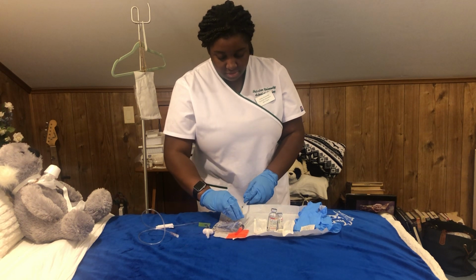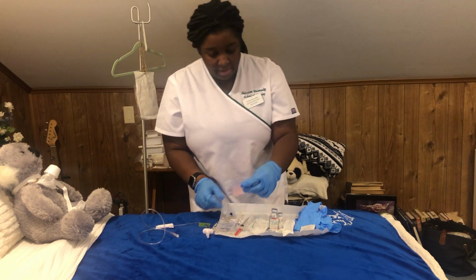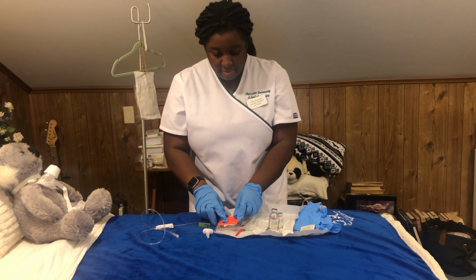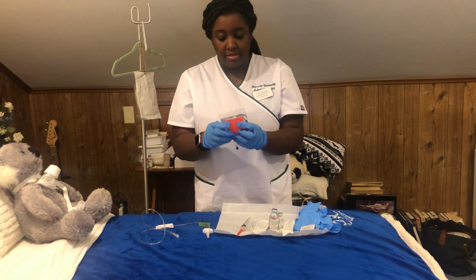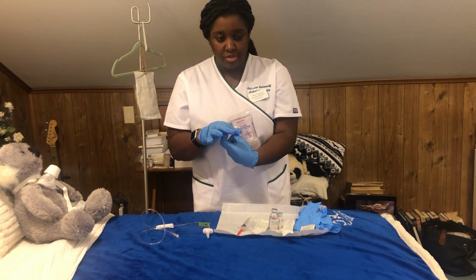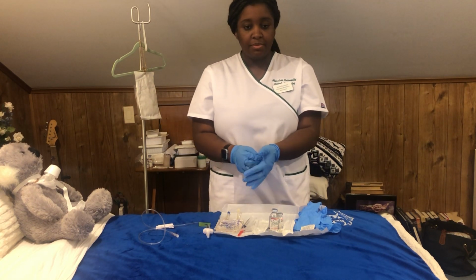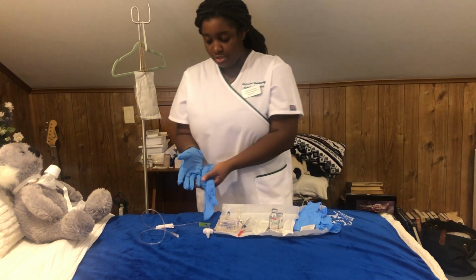Okay, and I am just going to discard my syringe into the sharps container, and then I will write the patient's name, date of birth, the drug, the amount, the dosage, time, frequency, and my signature, and staple that and attach it to the pouch with the back so that the medication names and everything is showing. Okay, and then I will just perform hand hygiene and take this medication to the patient's room.